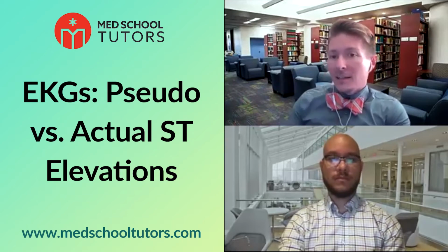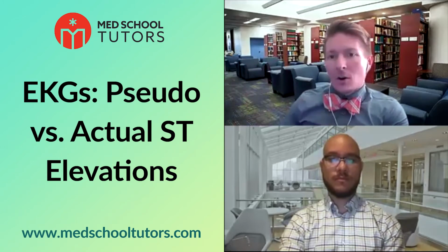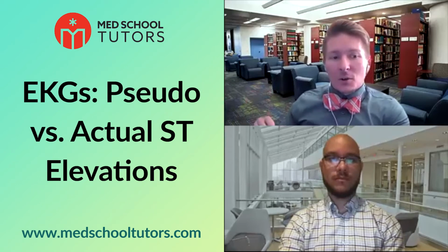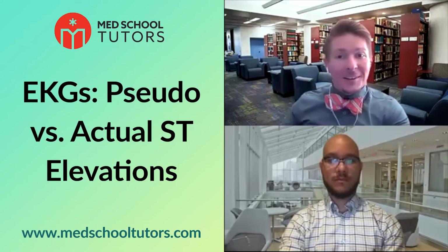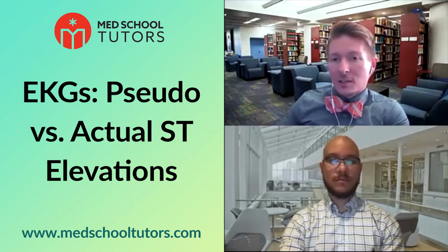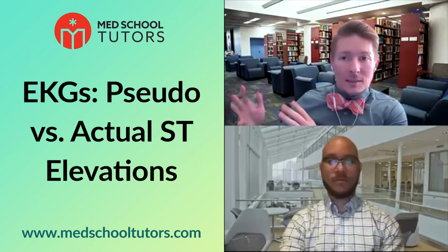And if you find that every lead on the EKG has ST segment elevations, that usually is not a heart attack, because it would be strange to see a heart attack in literally every artery on the heart at the same time. So instead, we would say, an excellent answer from somebody in the chat, pericarditis is usually what we see for pan-ST elevations or diffuse ST elevations on the EKG. So myocardial infarction, localized ST segment elevations; pericarditis, global ST segment elevations.